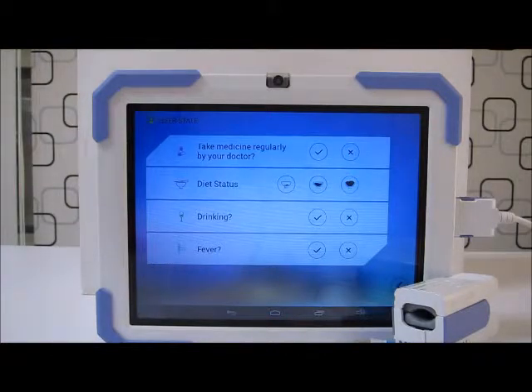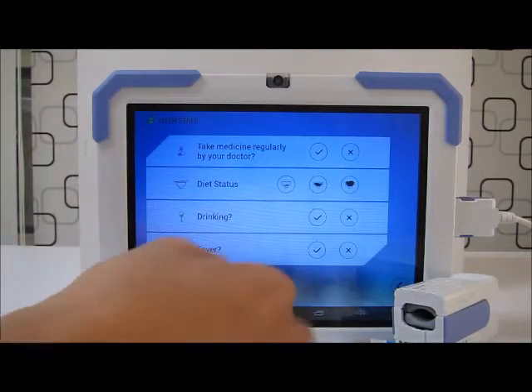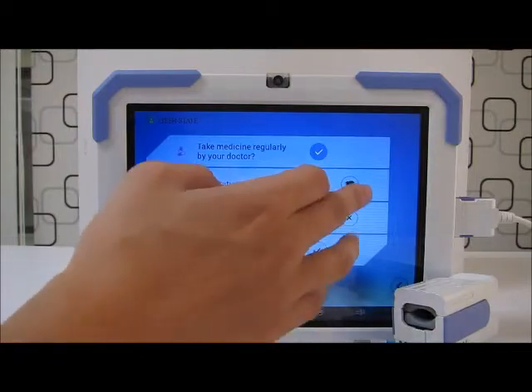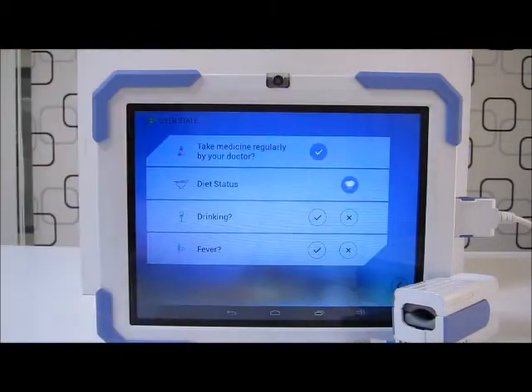The next screen prompts me for more information. In the morning I took my medicine as instructed by the doctor, so I'll press the tick. I ate a lot for breakfast, so I'll press the fullest button — and no drinking, no fever.